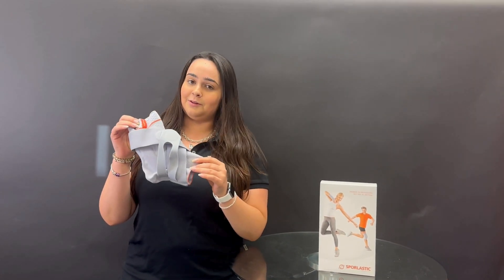Hi everyone, my name is Rachel. I'm the registered kinesiologist on staff with PhysioSupplies Canada and today we are going to be doing a training video on our ankle brace, the fibula tape.